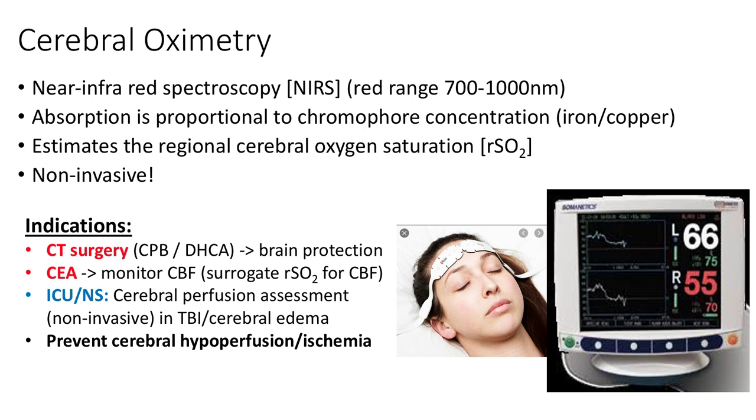In the ICU, also here this modality has been used for cerebral perfusion assessment as a non-invasive modality in traumatic brain injury and cerebral edema, or when you worry about cerebral hypoperfusion ischemia. The limitation of this modality, there was a lot of concerns, worried about can this technology really monitor deeper brain structures, and what's the contribution of the extracranial blood flow.